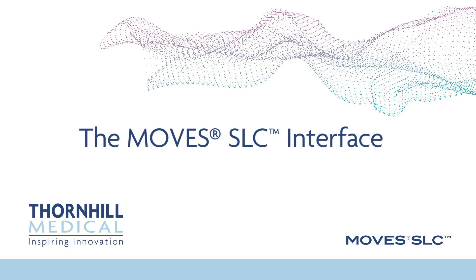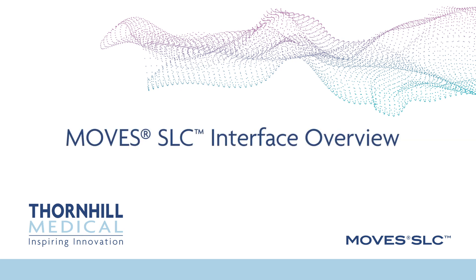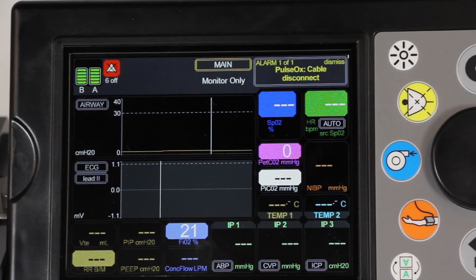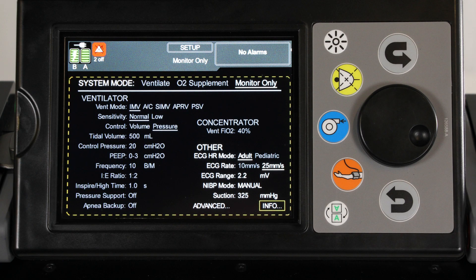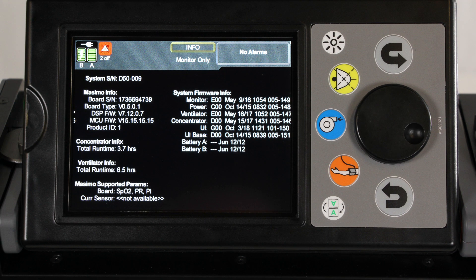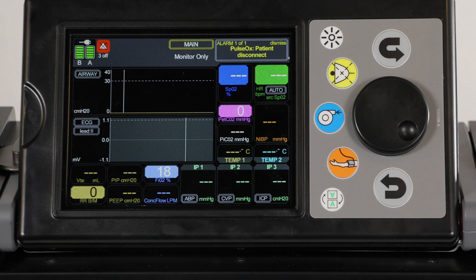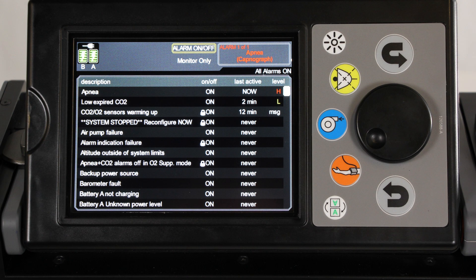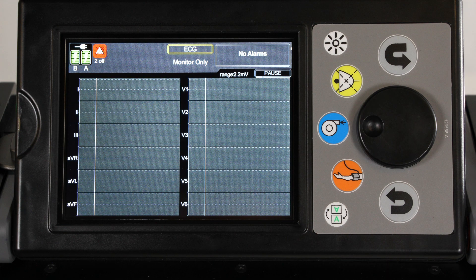The MOVES SLC Interface is comprised of multiple screens: the Setup screen to view and modify the primary operational settings of the device; the Advanced screen to view and modify advanced operational settings; the Info screen to view system information; the Main screen to display patient status and monitored values; the Alarm Limit screen for control of alarm limit values; and the Alarm On Off screen for alarm on and off control.